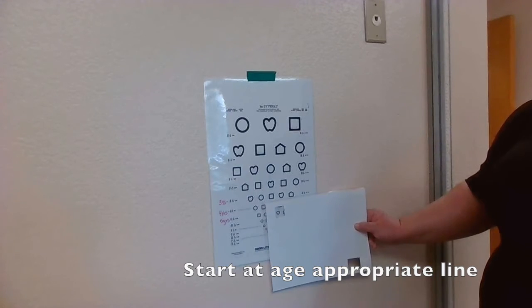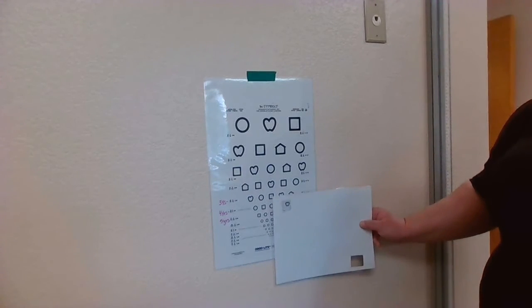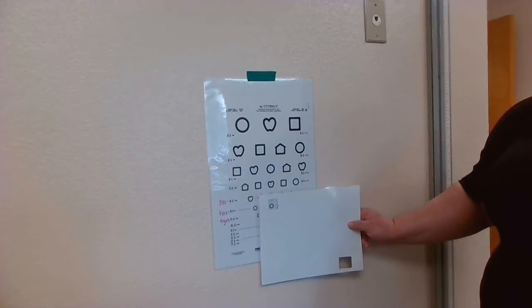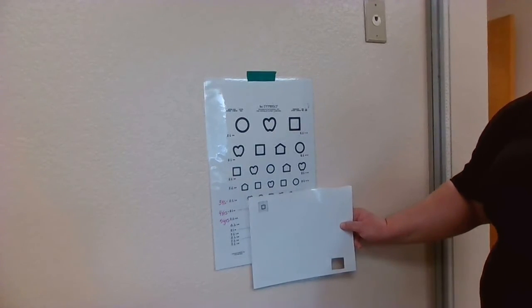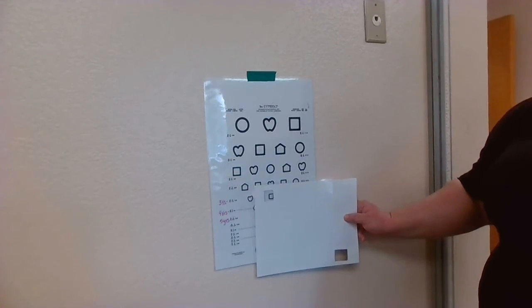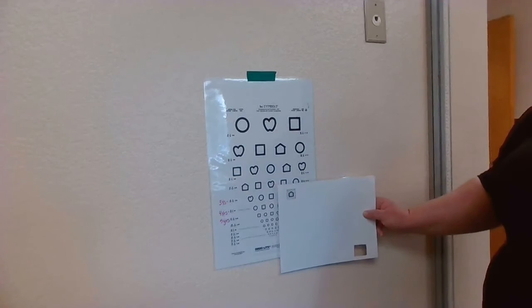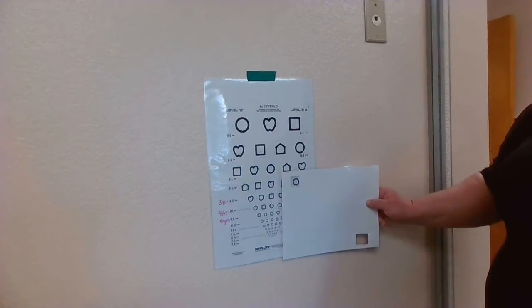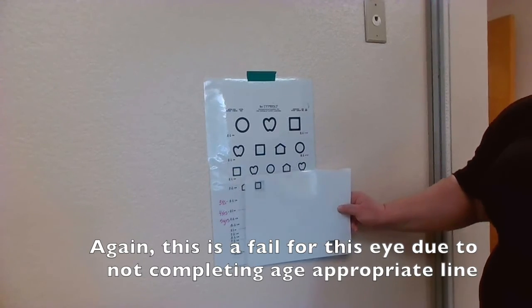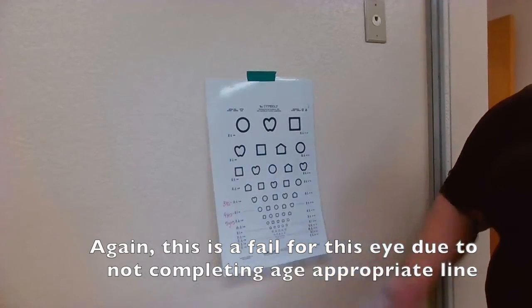Move on to the next eye and repeat the same process, starting at the age-appropriate line, moving from shape to shape. If the child does not get 4 out of 5 correct, you move up a line. Continue this process until the child gets 4 out of 5 shapes correctly identified. As you can see, for both eyes, the child did not identify 4 out of 5 correctly for their age, and has failed.